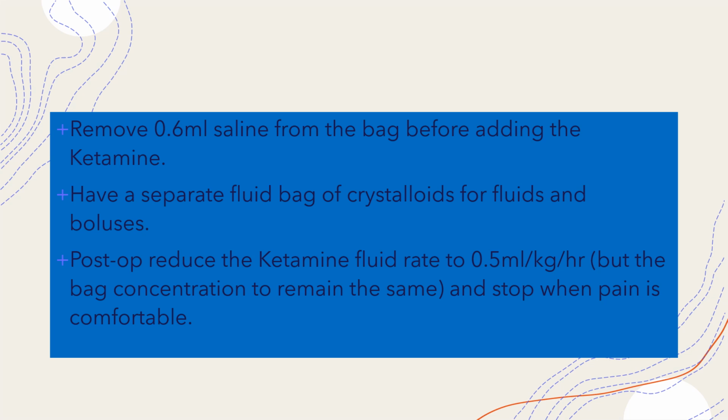Post-op, we usually reduce the ketamine fluid rate to 0.5 ml per kilo per hour, but leave the bag concentration the same, so you're effectively halving the dose, and then stop when the patient's pain is comfortable and you're getting a lower pain score.